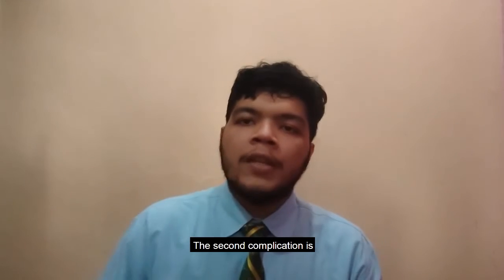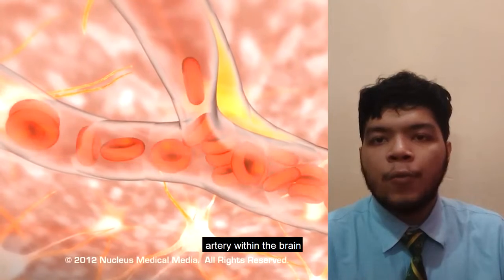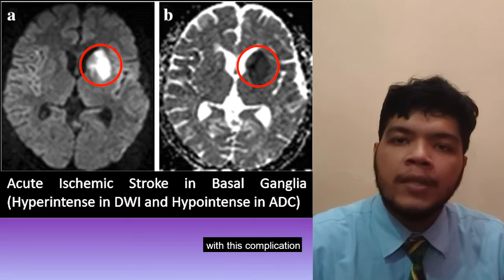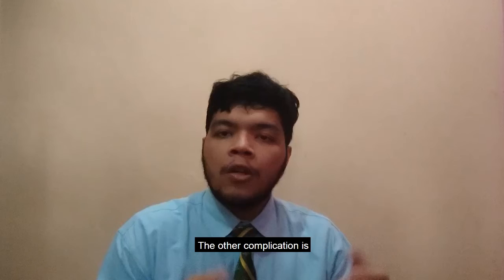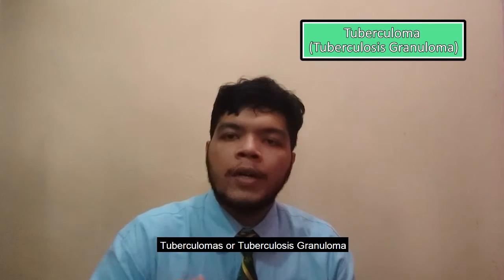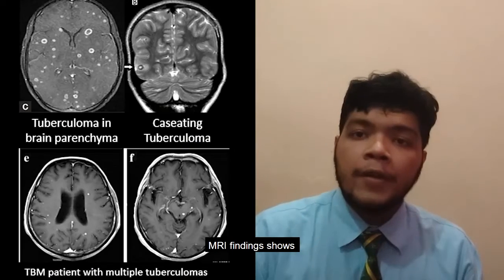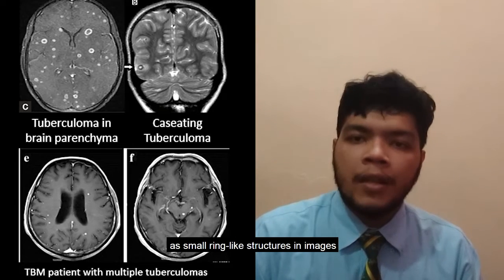The second complication is ischemic stroke. It happens when the blood in the artery within the brain is blocked by blood clots. MRI findings of tuberculosis meningitis patients with these complications are shown as bright areas in the images. The other complication is tuberculomas or tuberculosis granuloma. This is defined as a space-occupying lesion resulting from inflammation by tuberculosis. MRI findings show tuberculomas appear as small ring-like structures in images.